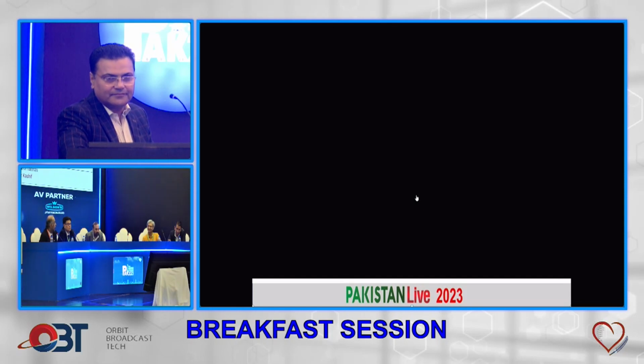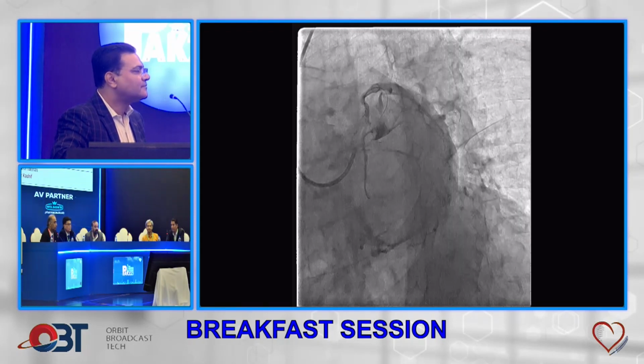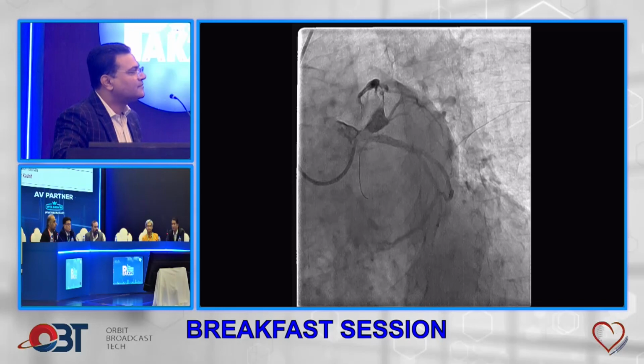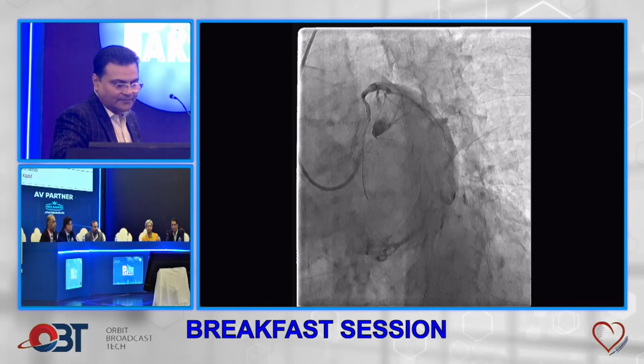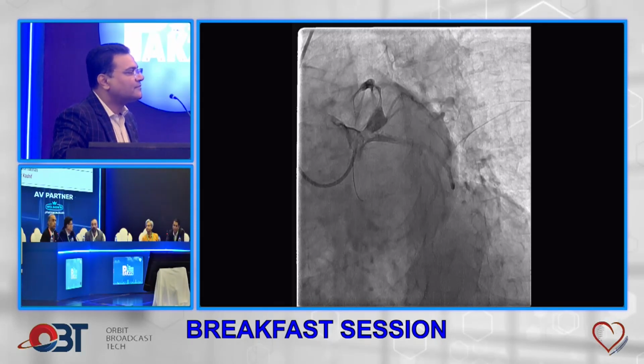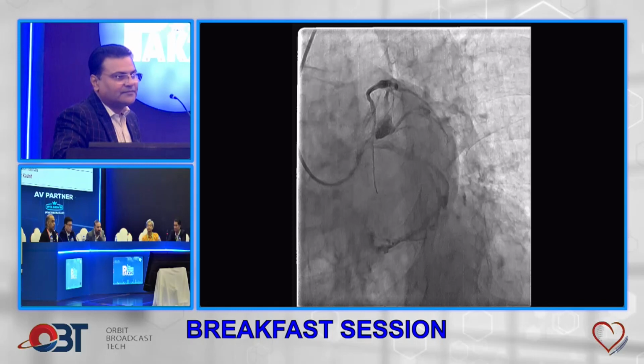So what would be your next line of action over here? Now this is acute MI. There is clot over there. You have opened a vessel now. Although it's very difficult to deploy any fully apposed stent here because it's an aneurysm. One option is to do the IVUS to see what actually it is, what's the size of this, how you can deploy a stent there. Again, in acute MI, it is very difficult to go for IVUS theoretically, but in acute MI, we can give Aggrastat and then deploy a stent there. Try to put it in the neck so that we can just deploy it. It should not be hanging in the aneurysm.